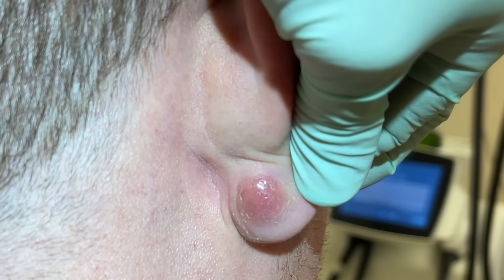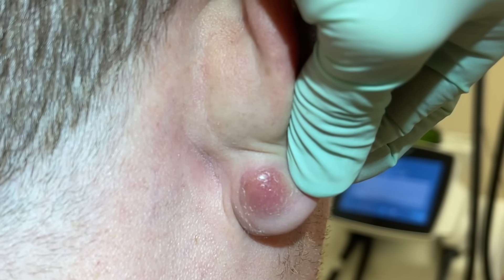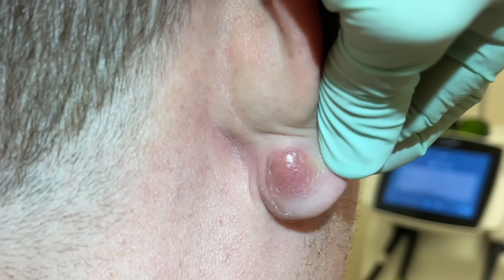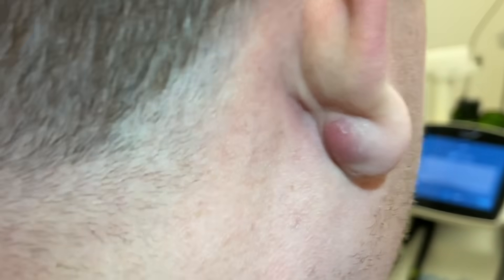If not, depending on what I see, sometimes we'll leave it open so it can drain for a couple days and maybe start an antibiotic and see if we culture. So we'll get started right now.